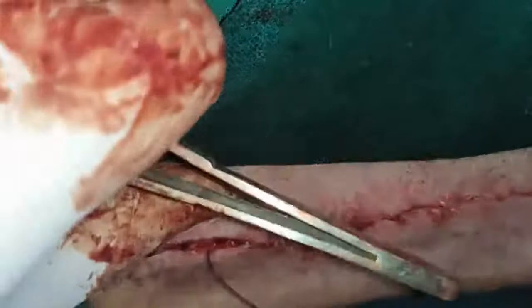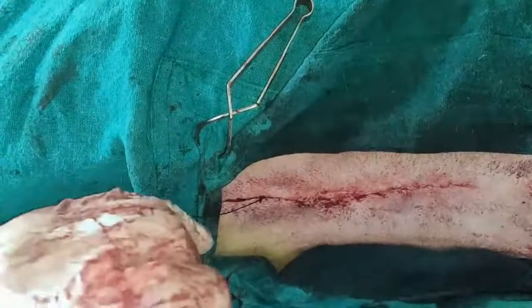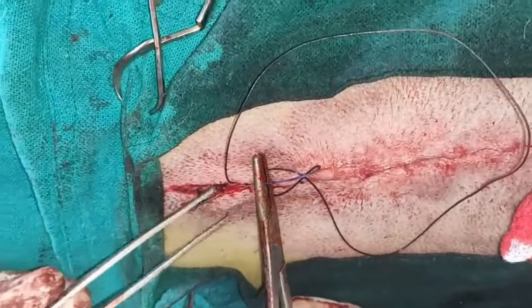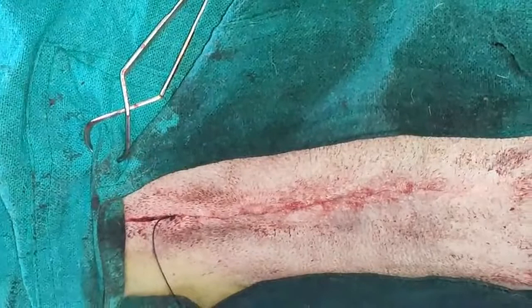If you see the cosmetic appearance of this suture, had it been a human, there wouldn't be a requirement of skin suture, but since our patient is an animal, we can't rely on the animal. Even though the subcuticular suture is very fine and the alignment is good, even without suturing the skin, you still have to apply a few sutures, because the animal may bite or lick.